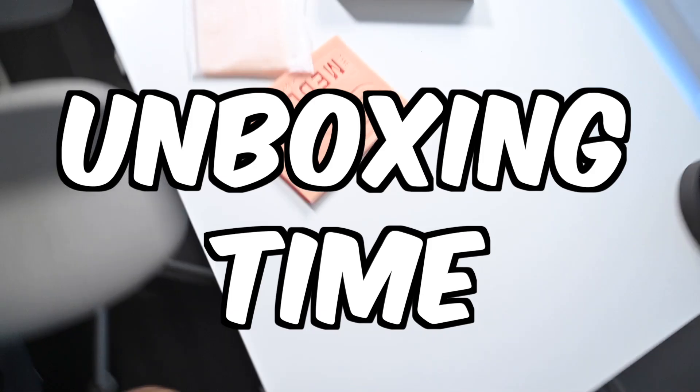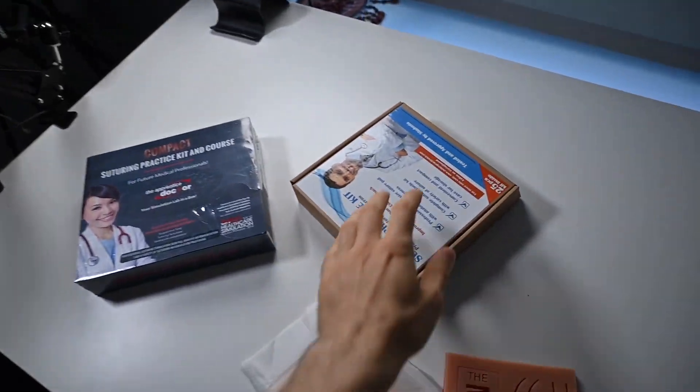Alright, cool it with the medical history on sutures. Let's get to the pads. It's my favorite time — unboxing time. The nice thing is that I bought all of these myself, so that means I can say quite literally whatever I want about them. Let's get into all of them, open them up, and see what they look like.